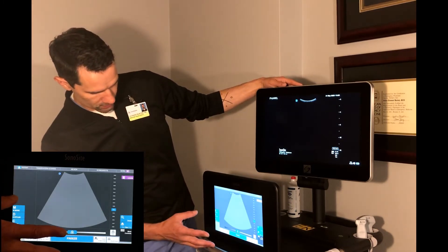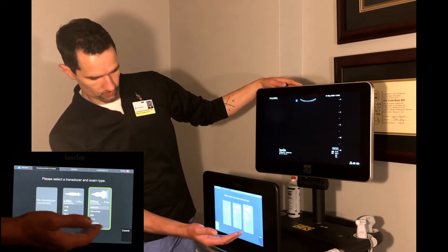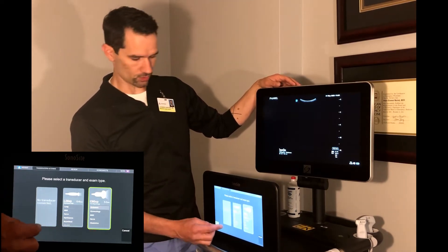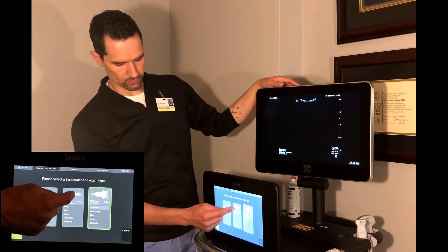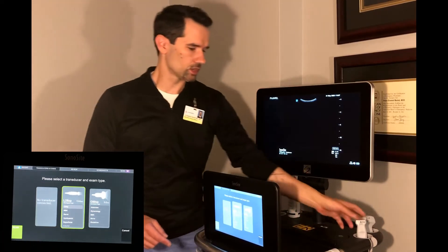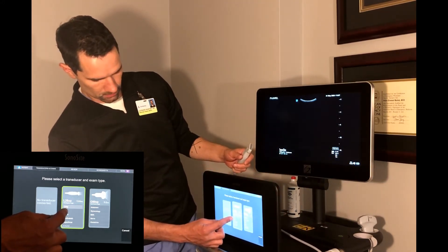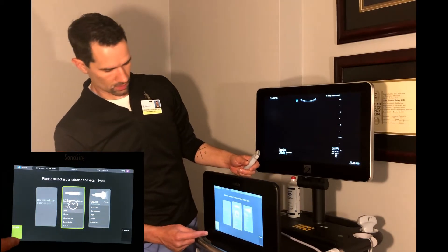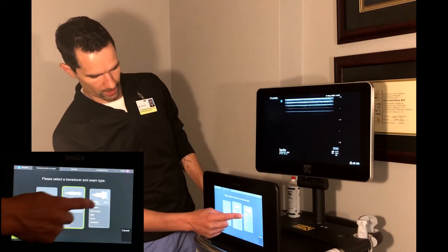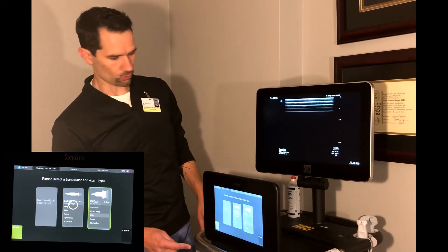You may need to change your probe. There's a button that says 'Transducers and Exams' which will show you the selectable transducers. At the moment we don't have our cardiac probe hooked up, but once our phased array probe is connected, it'll show up as well. You can select your individual transducer and also select the exam type — for example, select our L25 linear array probe, choose the musculoskeletal setting, hit scan, and it's ready to go.